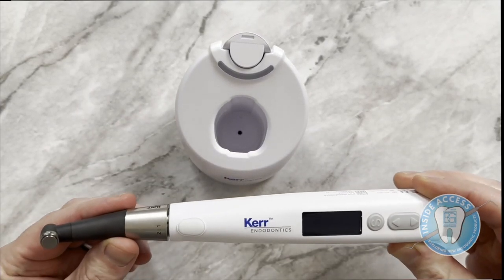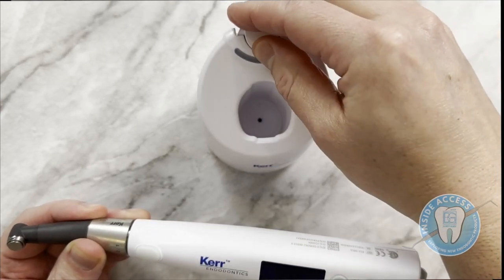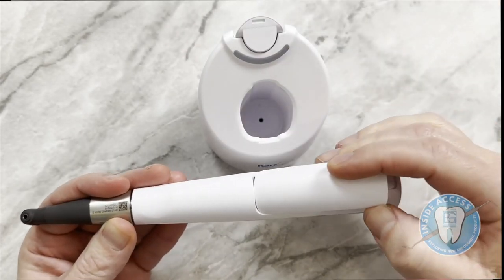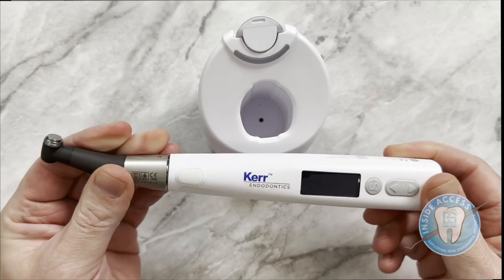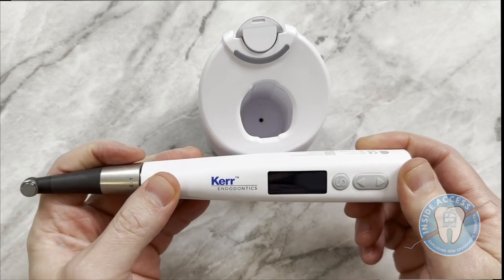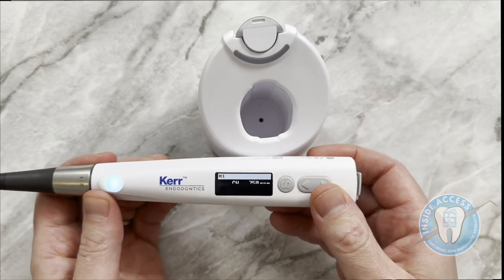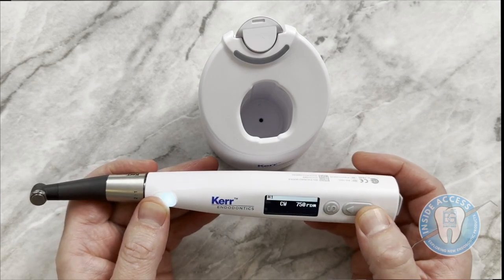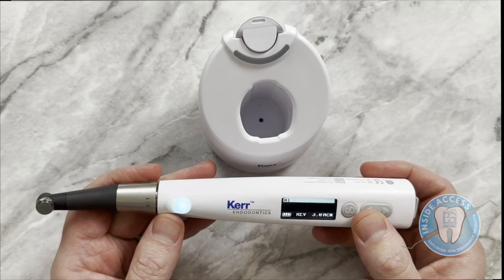Let's take a look at the Elements Connect motor — it has some cool functions. It charges through a battery port in the base, so you always have an extra battery charging. It's easy to flip the battery out and replace it if you run out of charge. The contra angle is a two-to-one ratio head, and one cool feature is that you can rotate it 360 degrees — very handy depending on the angle you need. I fire it up by hitting the rheostat button. The display can be adjusted for right or left-handed users. You can use this motor completely cordlessly, and it connects to the Apex Locator.